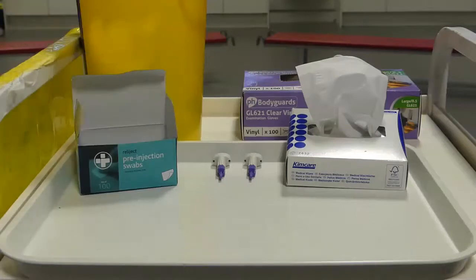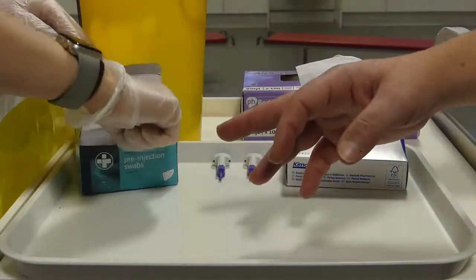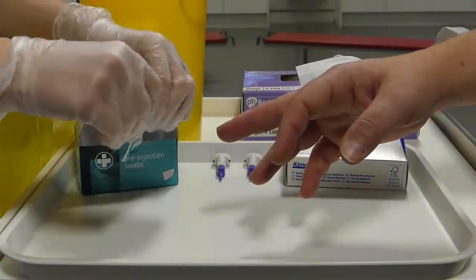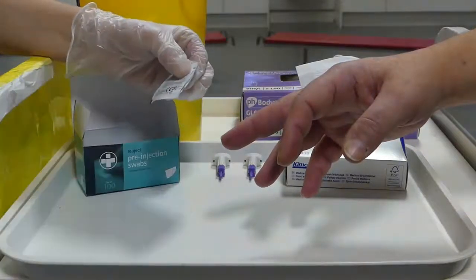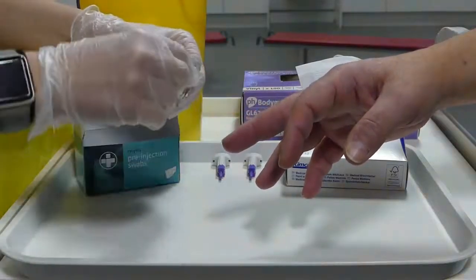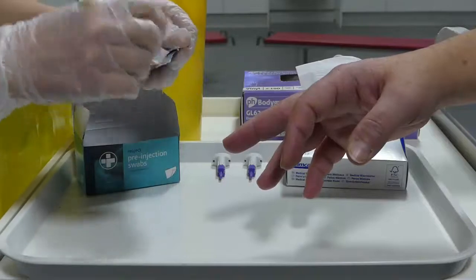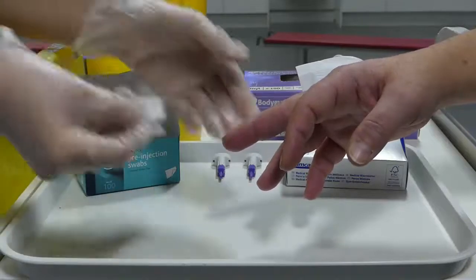Next we'll watch the process in which you can see first we use an alcohol wipe to clean the area where we're going to take the blood sample. Please note that throughout we immediately place all clinical waste into the appropriate bin and never on the work surface.